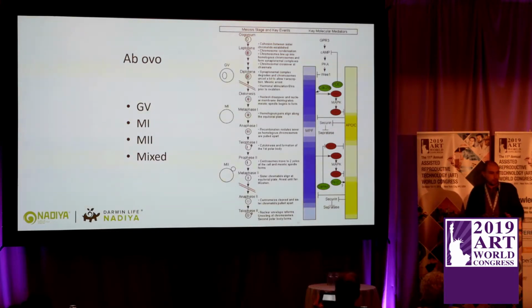We had this patient, she was 39 years old, and I will return to her a bit later. She had an absence of fertilization. She had a lot of oocytes during her stimulations, but none of them could be fertilized. So we had this M2 arrest of her oocytes. But after nuclear transfer, we achieved a normal fertilization rate and normal blastulation rate, but unfortunately all of her blastocysts were aneuploid due to age. But we'll return to her a bit later, if you remind me.